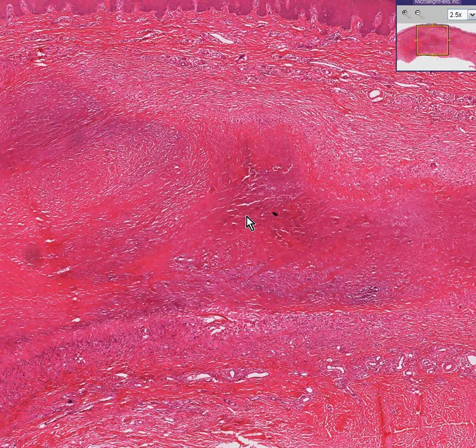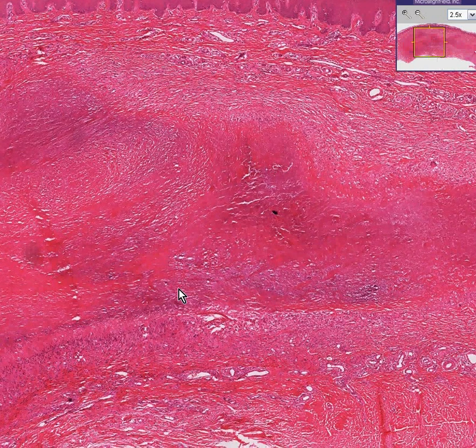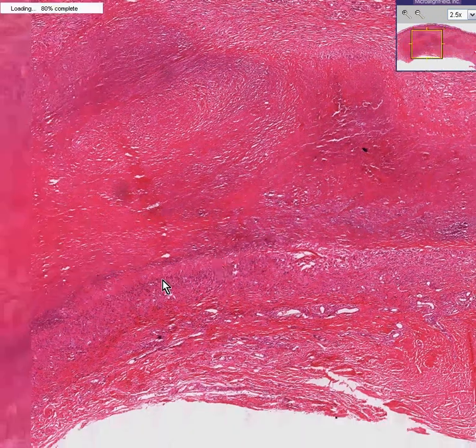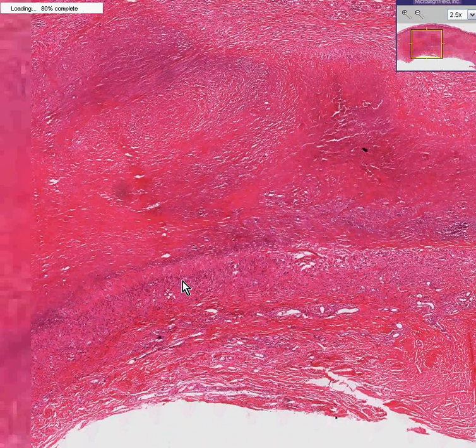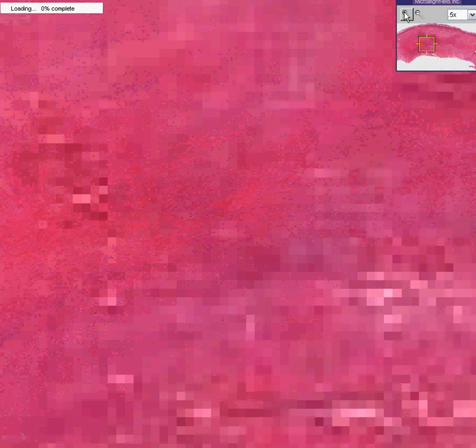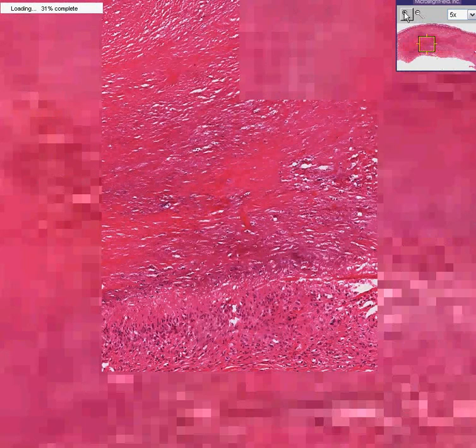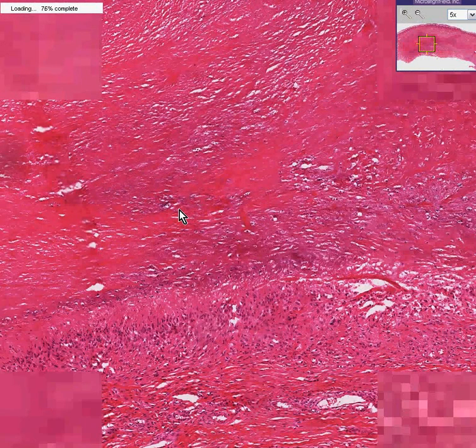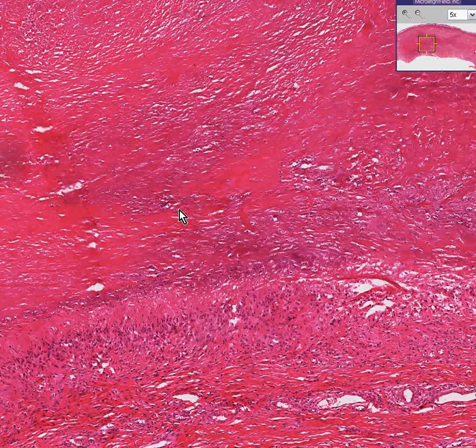It also may have some scar tissue in it and it also seems to be rimmed peripherally by inflammatory cells, chiefly lymphocytes. If you are thinking that this is reminiscent of a granuloma, I think you could, we could say you're probably correct. This is like a granuloma.